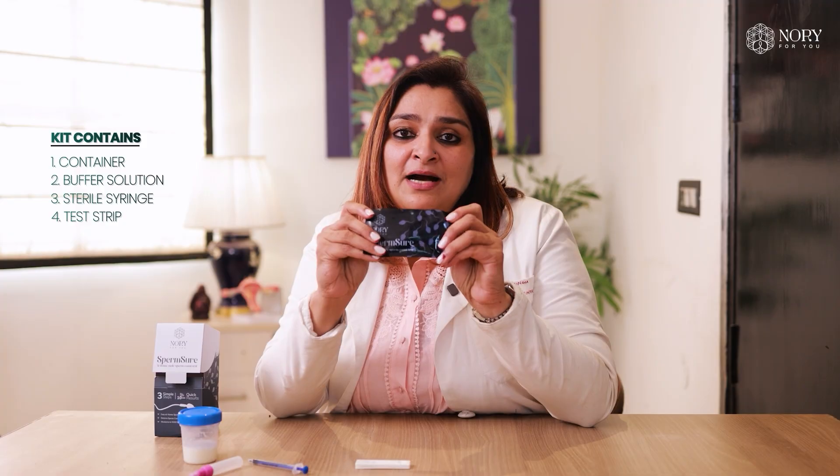How is this test done? When you open this box, you will get a container — an empty sterile container — a buffer solution, a sterile syringe, and a card test.